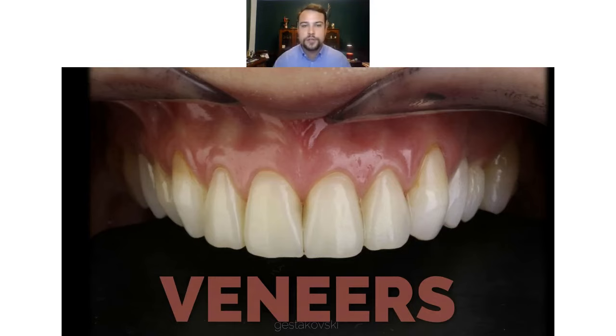Today I had 2 consultations for this kind of restoration, and the patients like the idea of seeing themselves before going for the final treatment. With freehand bonding, it's not possible, okay? But with the injectable technique, we can show them exactly how they will look, and later on achieve the same result.